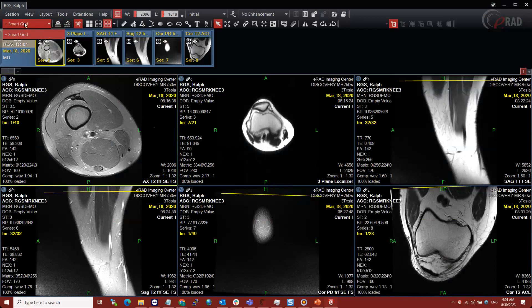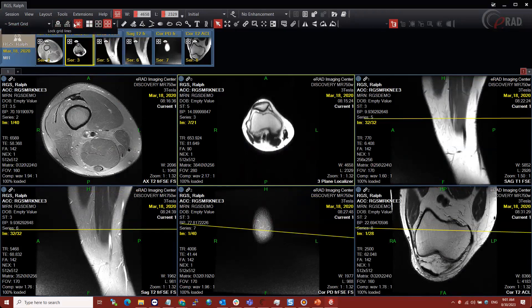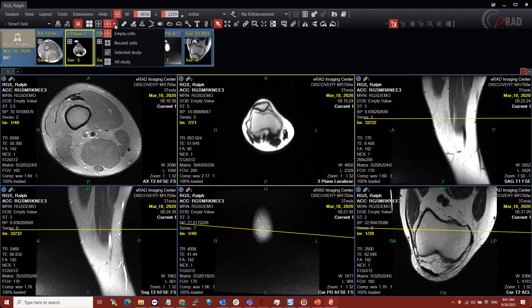I'm going to build a few, starting with some generic ones. We'll go over some of these tools up here. We've got this grid matrix, which is the main thing you'll use to change your layout — how many frames you're displaying. Next to that, we have what's called the grid fill mode selector. Right now I have mine set to empty cells. I have four options: empty cells, reuse cells, selected study, and all studies.